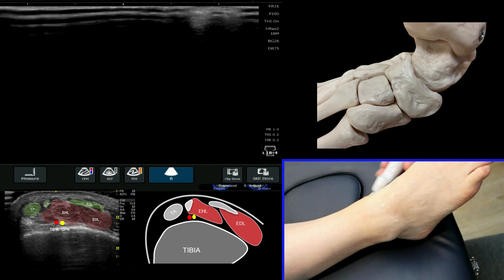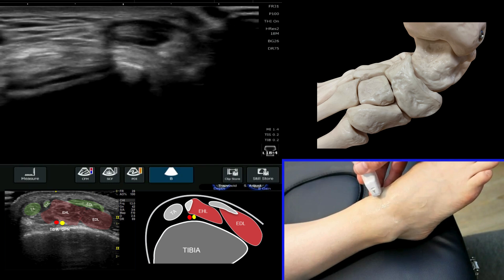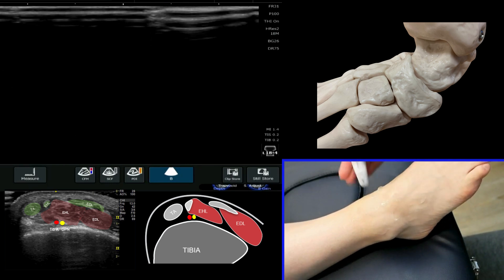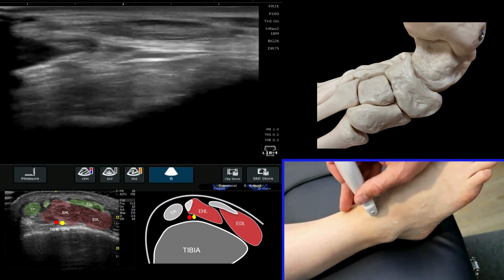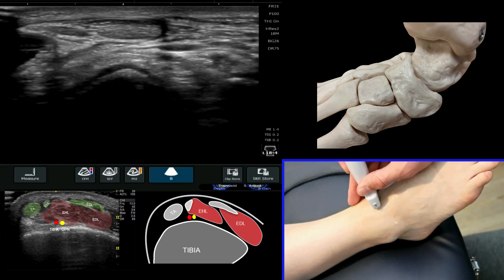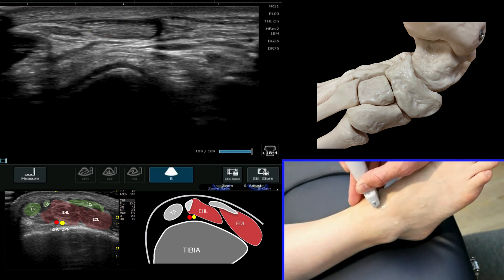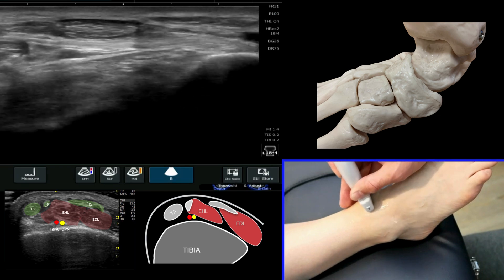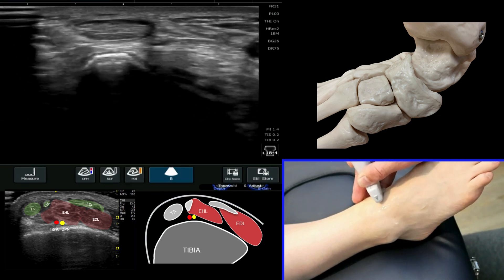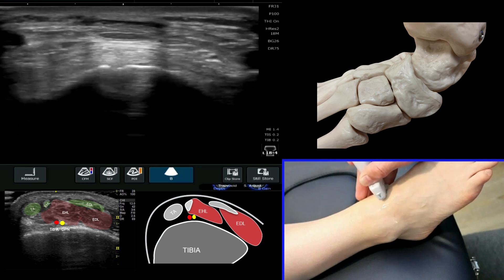If we use our ultrasound probe and place it onto the anteromedial aspect of the ankle joint, we're immediately going to see a very large tendon structure that looks similar to the Achilles tendon. This is your tibialis anterior in a short axis view, and it's a very useful starting point for looking at the anterior ankle soft tissue structures.